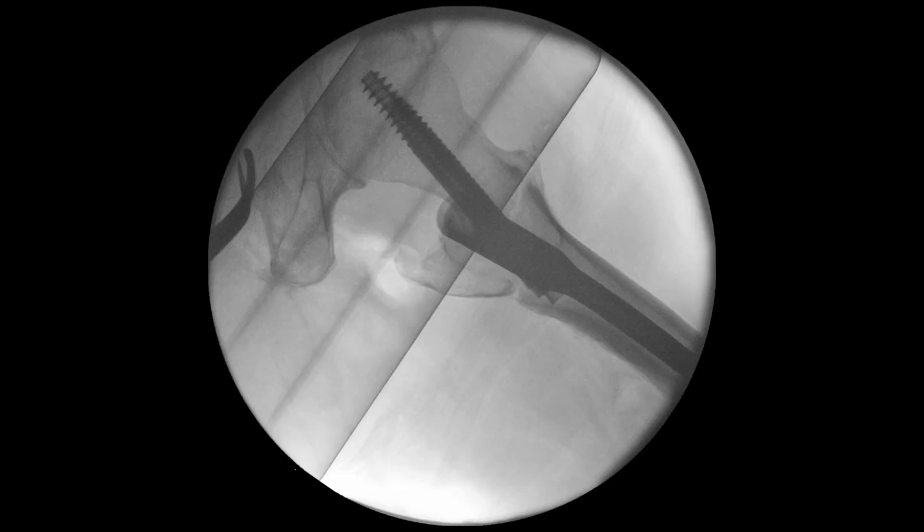If we accept the previous position, the screw tends to go toward the center, but the track it is following is quite dangerous — it may actually fracture the posterior cortex. This is not the outcome we want.